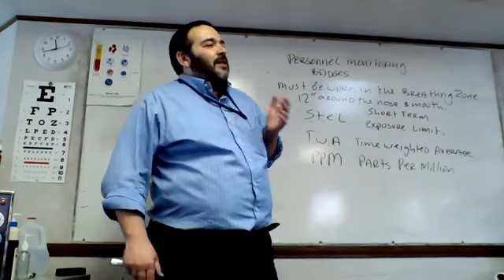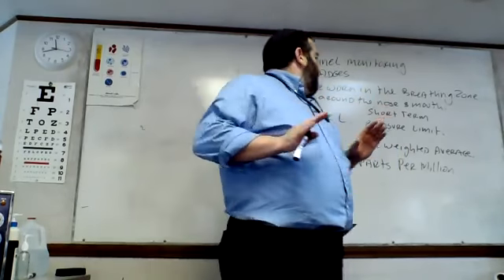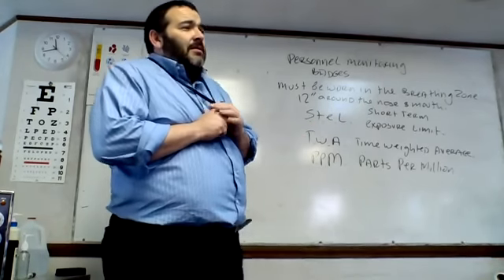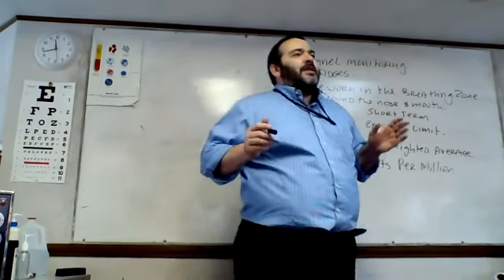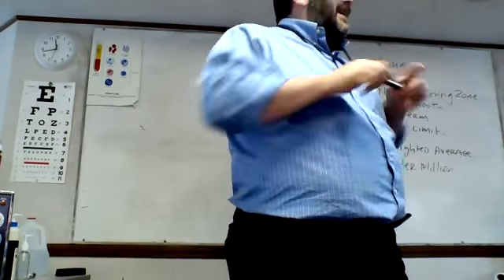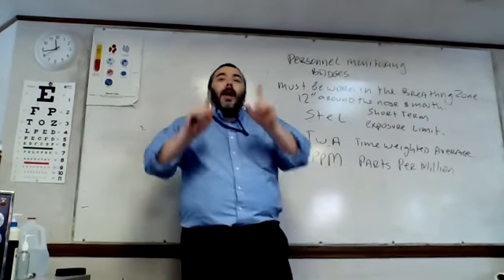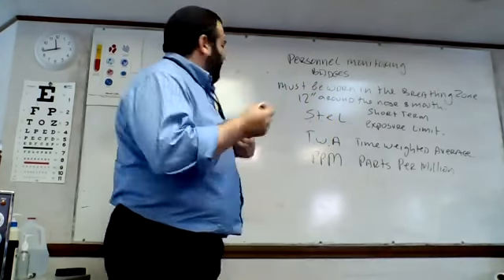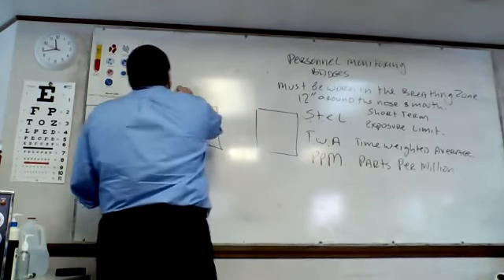Now, I have to tell you a little bit about the ethylene oxide cycle and how we handle things. Ethylene oxide used to be just like your washer and dryer, two separate machines. Today, they only manufacture one unit that does the sterilization and aeration all at once. But for the purpose of the exam, you need to understand that there are two machines: sterilizer and aerator.